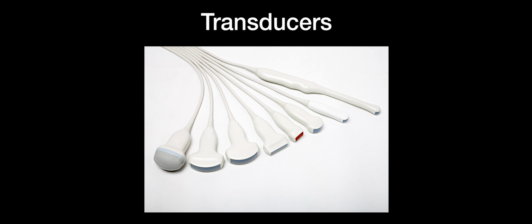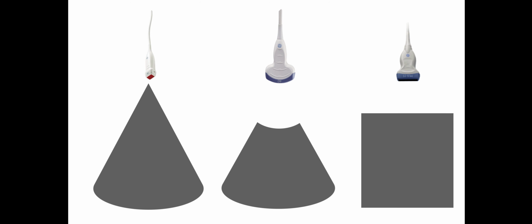We'll touch briefly on some of the other transducers, but for the most part, we won't have any desire to go through cavity transducers in this circumstance. The type of picture and shape of the ultrasound screen that you're going to see with a phased array is because this is a very, very narrow beam at the start that's spraying out in all directions to get through the narrow gap between ribs here and here.